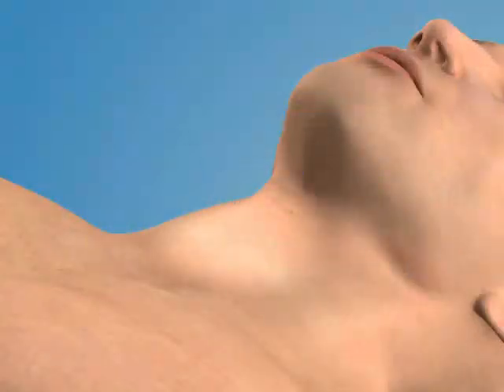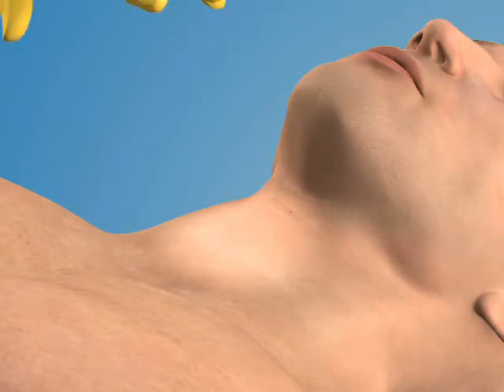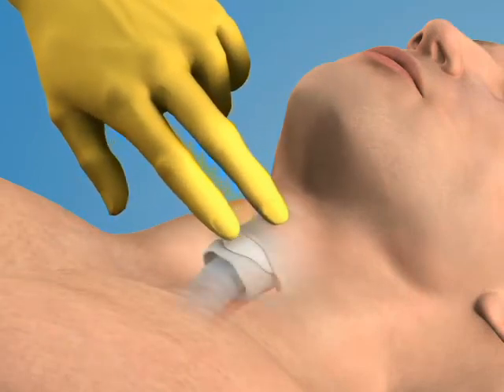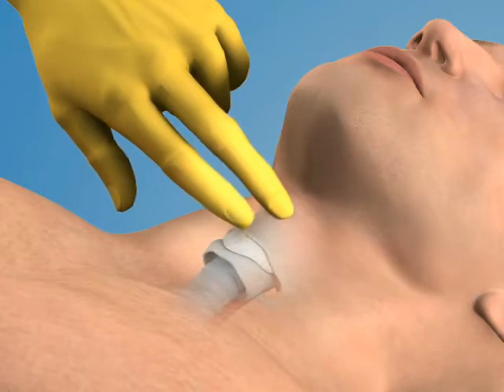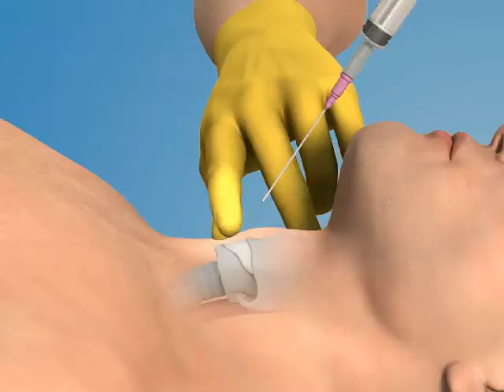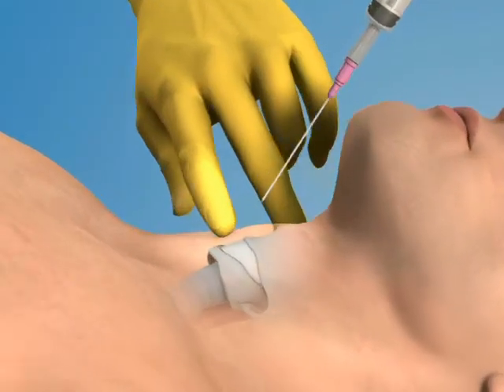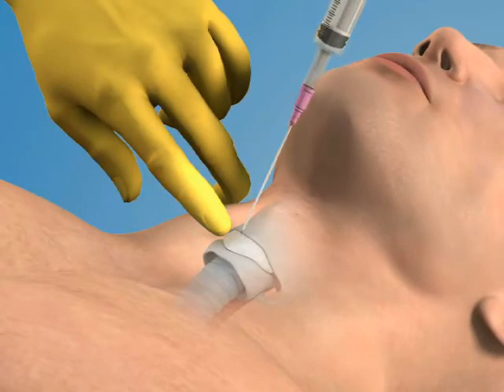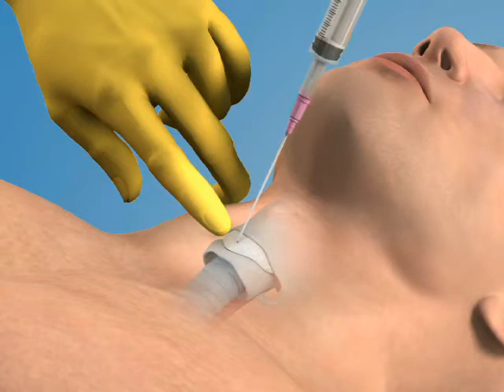First, locate the cricothyroid membrane using your non-dominant hand. Remember, the membrane lies inferior to the prominent thyroid cartilage. Direct the over-the-needle catheter and syringe assembly in a caudal fashion and pierce the cricothyroid membrane at an angle 45 degrees relative to the skin surface.